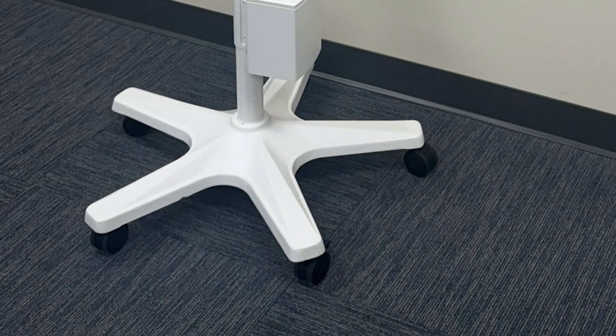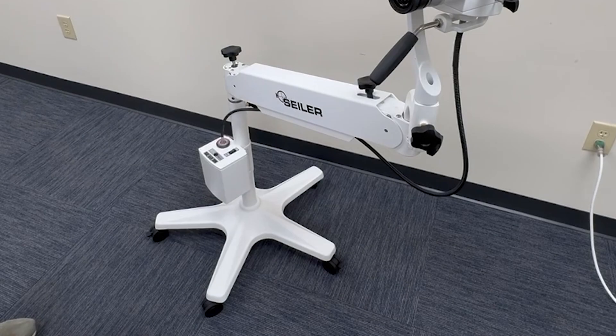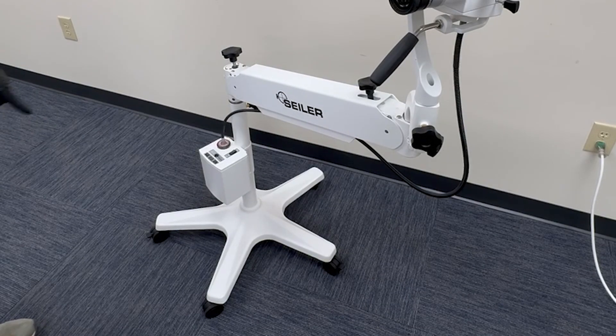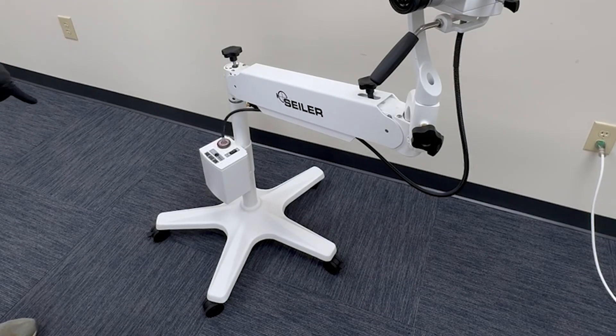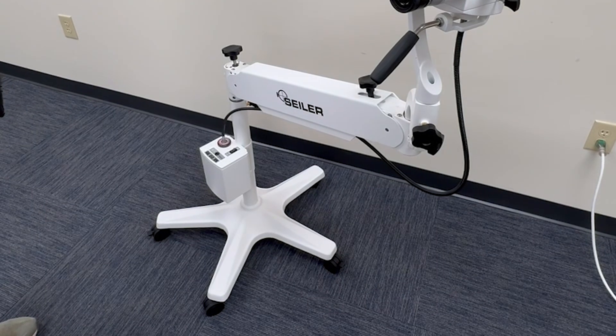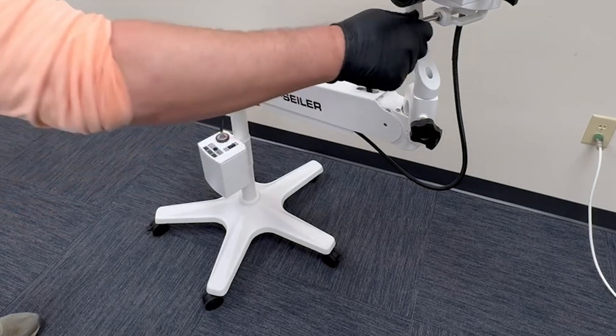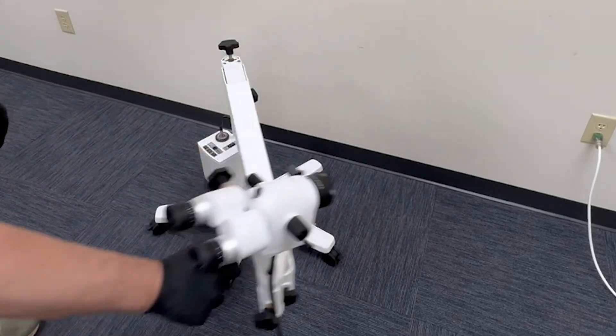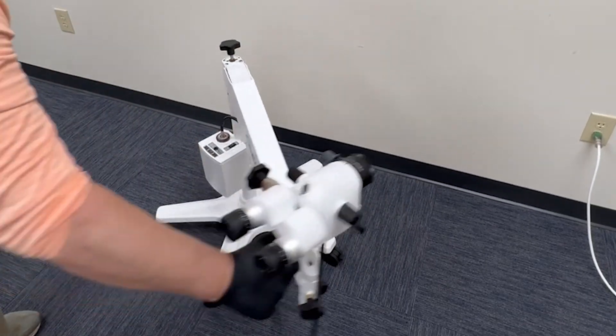The 955 Colposcope sits on a 5-star, sturdy base. Each Colposcope is equipped with three locking casters, ensuring that the base can be securely locked in place whenever necessary. This feature guarantees that the Colposcope remains stable and stationary during critical examinations, providing both safety and precision.